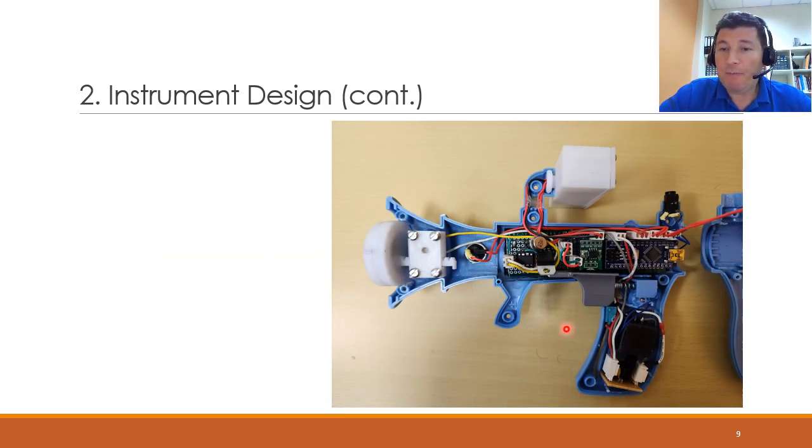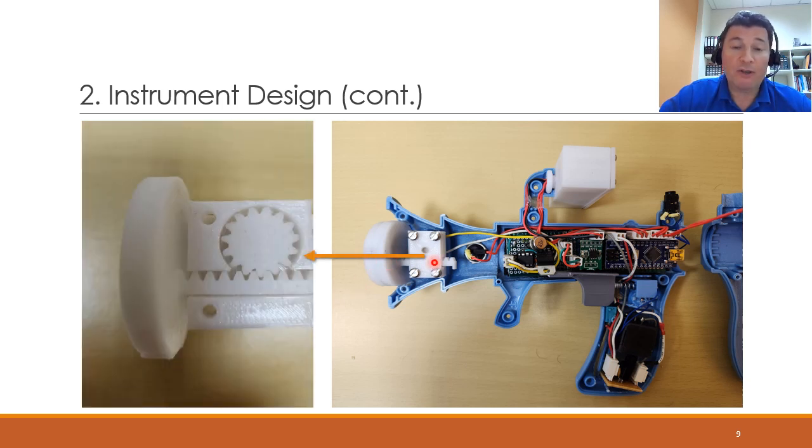Here is the instrument from the inside, where you can see all the components: the microcontroller, the digital potentiometer, and the amplifier. The exciter is inside the 3D-printed housing. We also 3D printed the housing for the display and the mechanism that allows the exciter housing to move vertically. You can see the gear mechanism here that converts the rotational movement of the shaft into a linear movement, allowing vertical motion as explained earlier.